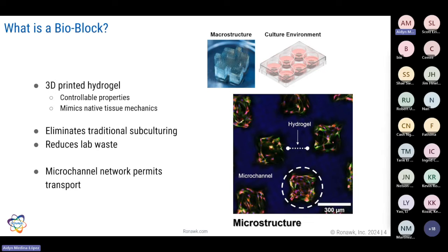As a difference to other 3D printed hydrogels, we don't embed the cells in the hydrogel. The cells actually coat the surroundings of the hydrogel, using our hydrogel just as a scaffold to form their own architectures and behave however they want to.